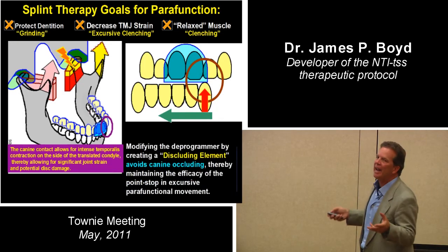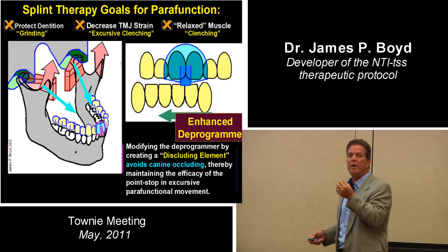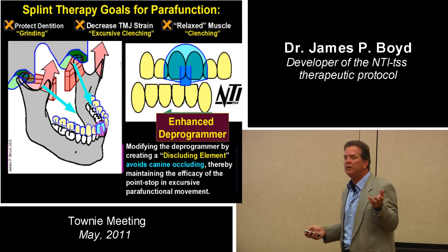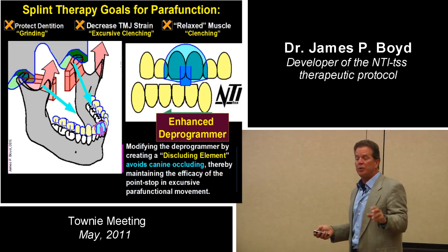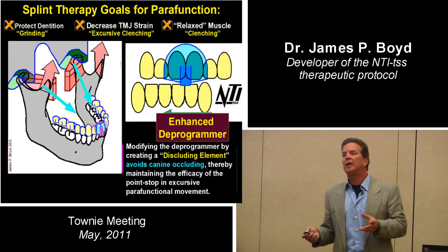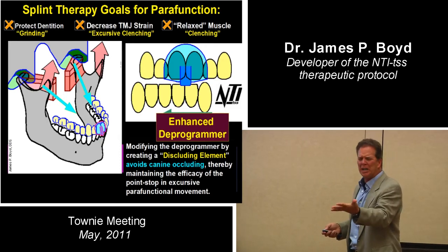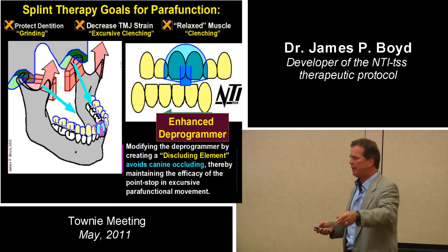And now it's an enhanced deprogrammer. This was the original design of the NTI devices because it worked for me. I'll boil down to that. It just worked for me. Then I started treating patients and it wasn't working for them. They had really weird symptoms that I couldn't figure out because I wasn't doing it myself. So I changed my thinking and said, what's a girl got to do to have her feel that way?